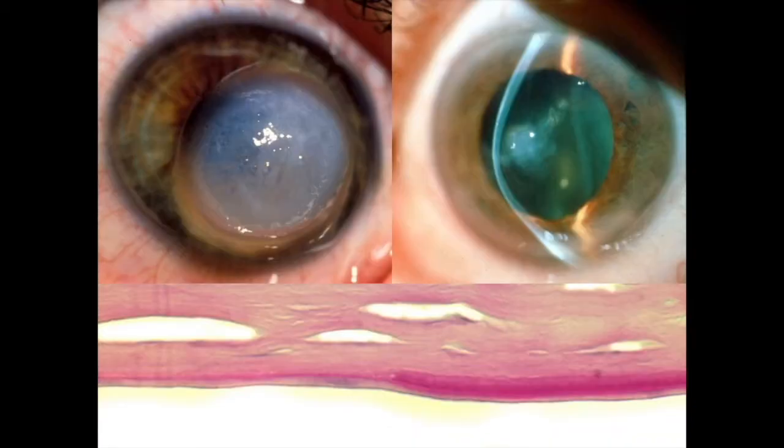This is a photo of acute hydrops. The acute phase is shown at left, and the same patient shown at right after partial resorption. The histopathology below shows that the corneal endothelium has migrated, filling the gap, and is now laying down a new thin layer of Descemet's membrane. So, acute hydrops. This is a Fleischer ring, a ring of iron in the corneal epithelium surrounding the cone.